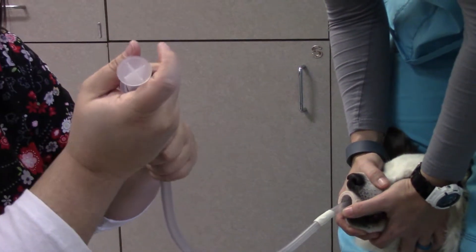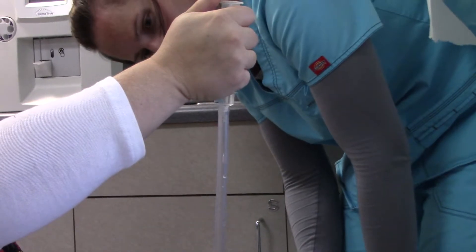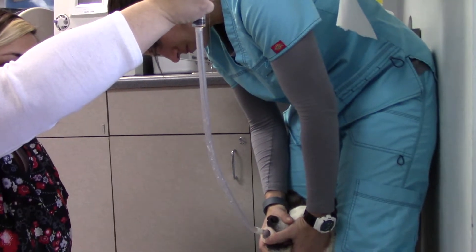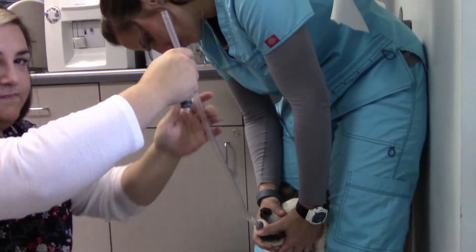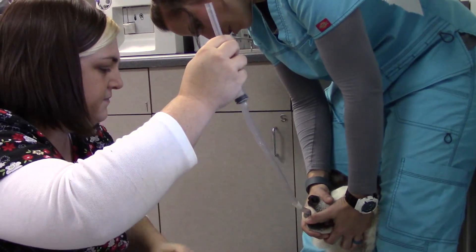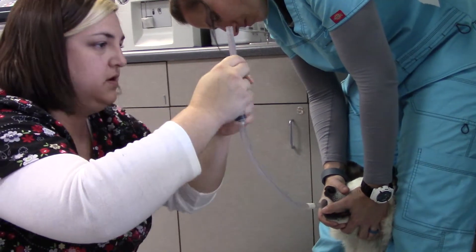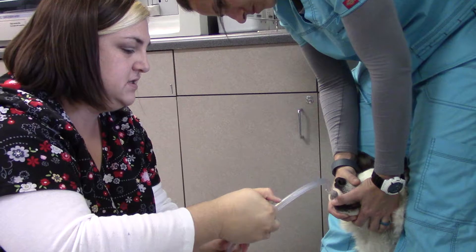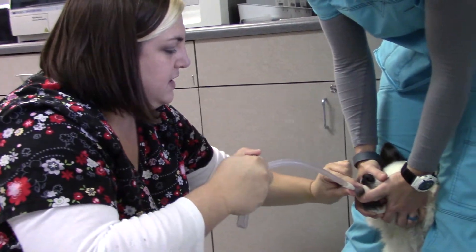Okay. And then take your saline, put about five or six mils into the tube. And you observe for coughing to make sure that it's not in the trachea. Good job. And then you would go ahead and put your medication in. And then when you're ready to withdraw it, you want to make sure that you plug or kink the end of the tube so that you don't leak anything and have them aspirate on the way out.